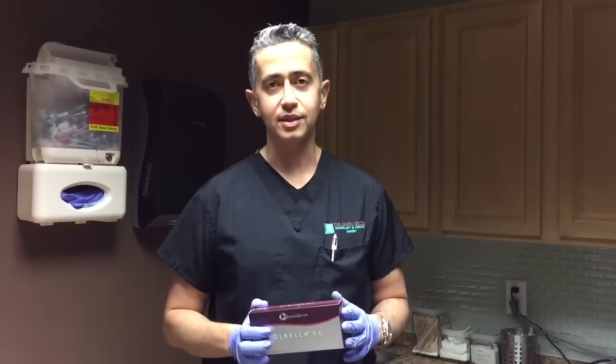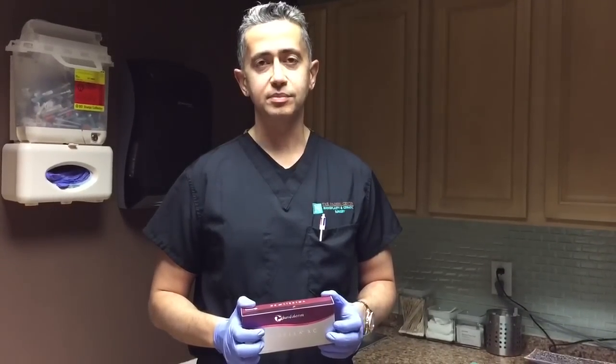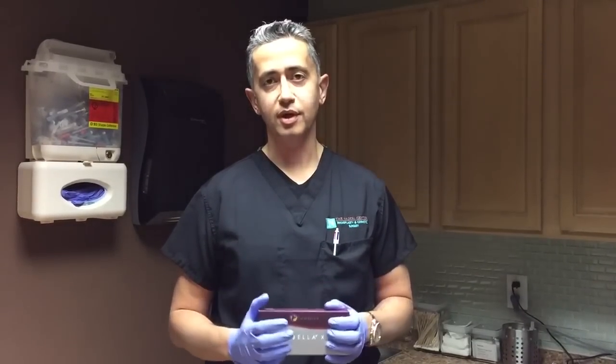We'll make another video for the injection series. You may have heard the buzz about Volbella. It's the newest offering from Allergan. It's a Juvederm product. It's basically similar to Voluma. Its cross-linking is more similar to Voluma, a little bit more of a lifting structure, a little bit higher G prime, as opposed to regular Juvederm products that are softer, a little bit more concentrated.